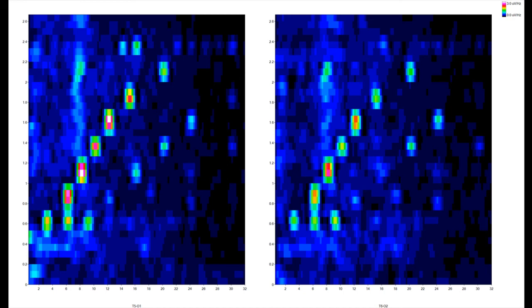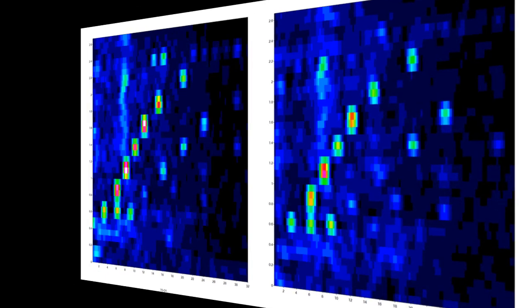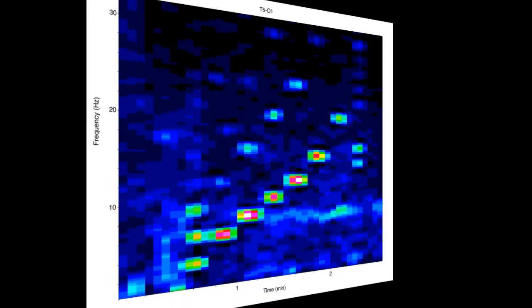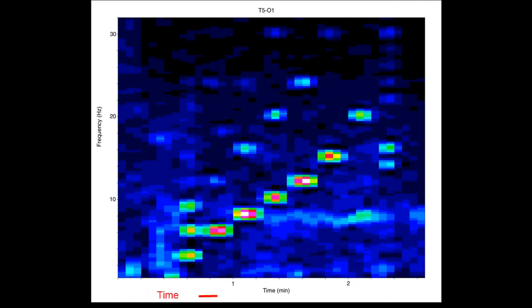The representation of the density spectral array seen here still differs in a significant way from our mind's picture of the standard representation of an EEG tracing. In an EEG recording, time proceeds from left to right on the x-axis. The DSA can easily be brought into this orientation by rotating it so that time is represented as flowing from left to right on the x-axis.